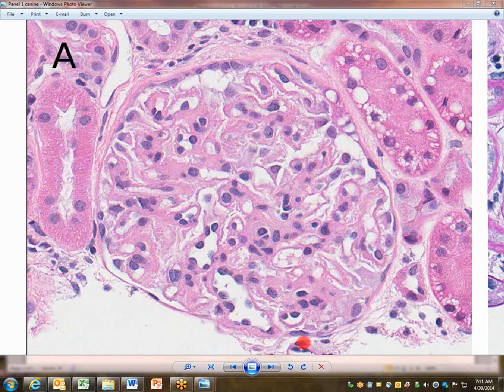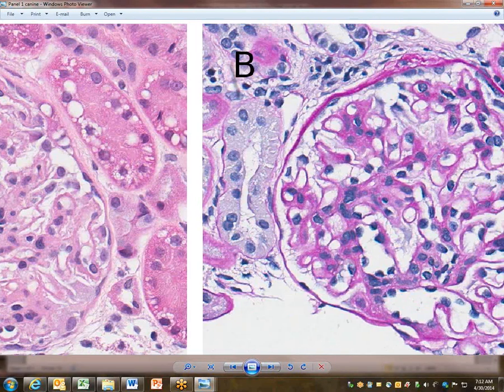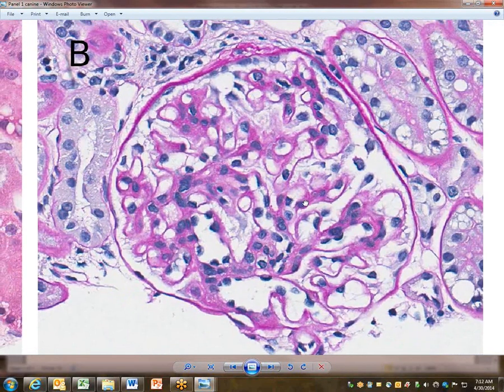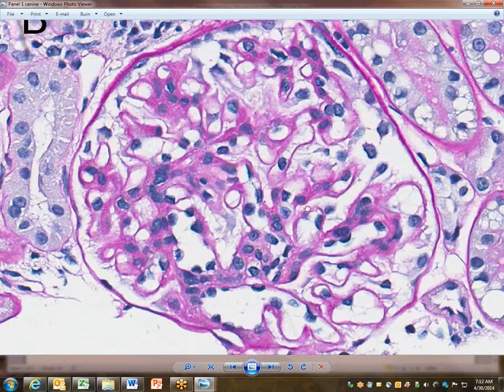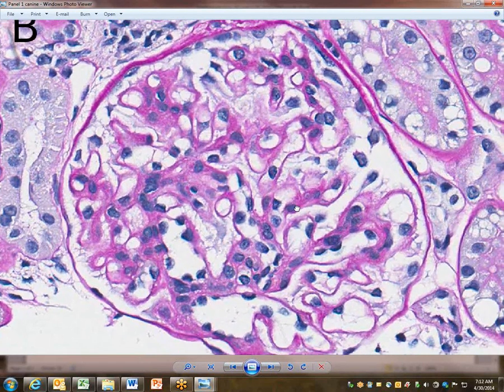So we can go to... All right. Let's see. Give me just a moment. I have to switch back and forth. Did you want to do the PAS next? Yeah, sure. I didn't have too much to add, though.